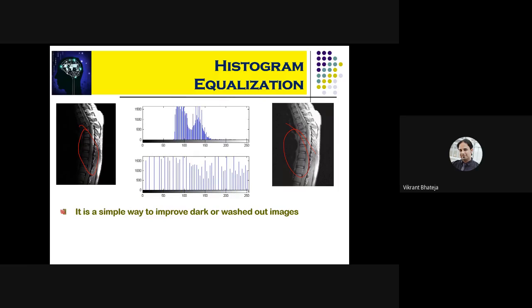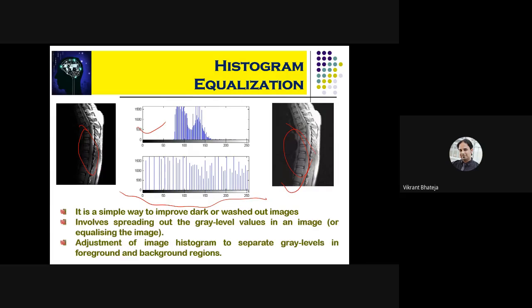And the idea is that suppose I have a histogram of this particular image. Now you see that the histogram of this particular image is focused, or narrow, to certain types of pixels only. But with histogram equalization, we have tried to spread the spectrum of these pixels, and you see that the resultant image has become brighter in comparison to the previous image. So this is what happens in traditional histogram equalization when you apply it to medical images.